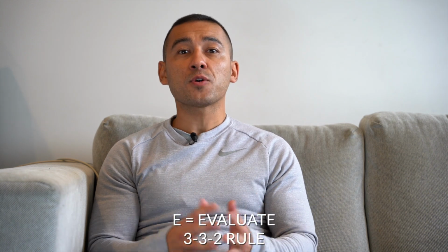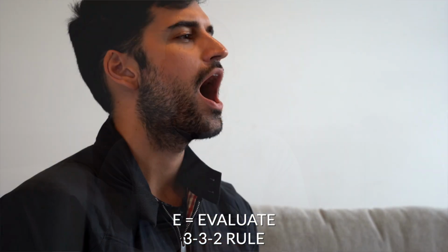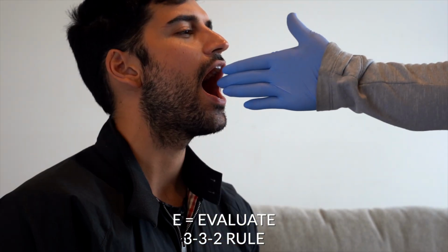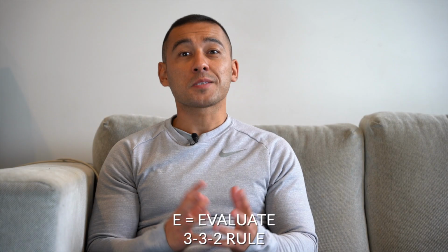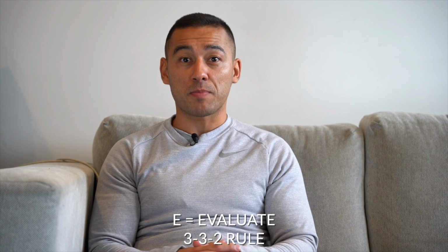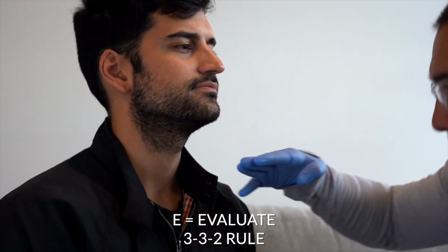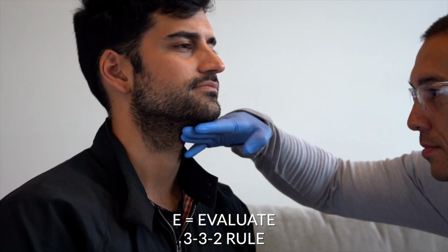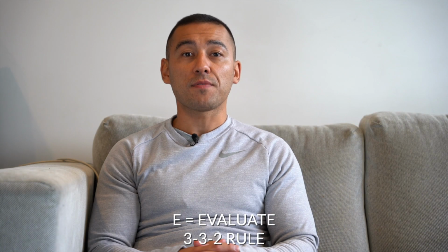E stands for evaluate using the 3-3-2 rule. Within the 3-3-2 rule, the first three evaluates adequate mouth opening. To do this, check that the patient's mouth can open to accommodate 3 fingers. The second three evaluates whether the mandibular space is large enough to allow proper displacement of the tongue during laryngoscopy. To do this, check that the distance between the tip of the mentum and hyoid bone can accommodate 3 fingers.